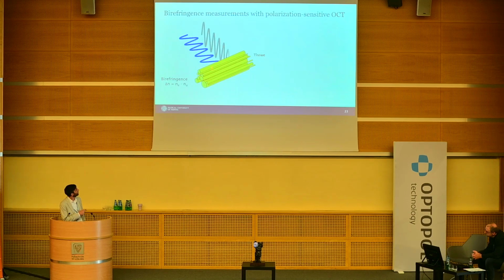And if now we shine differently polarized light through this fiber bundle, because the speed of light, the refractive index, is different for light polarized perpendicular to the fibers as compared to light polarized parallel to the fibers.